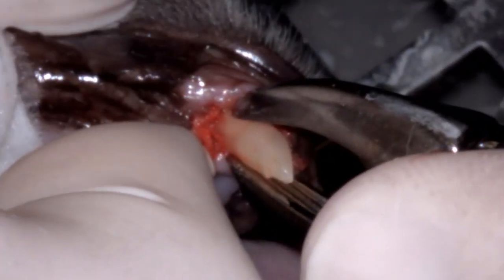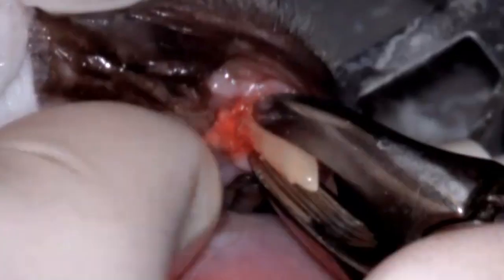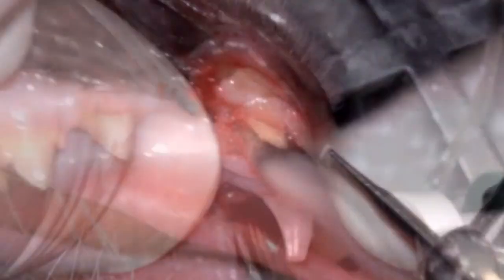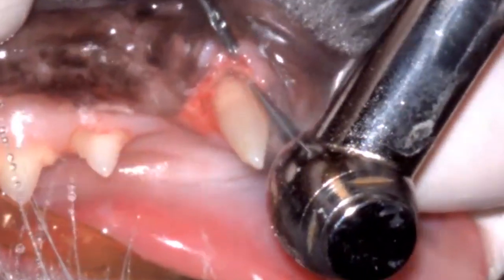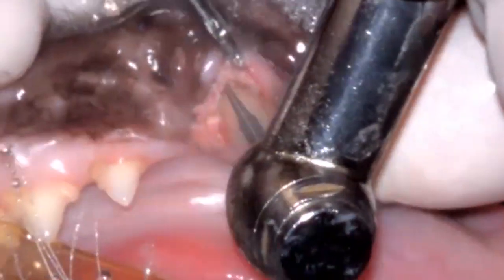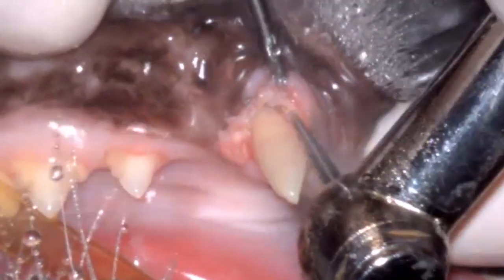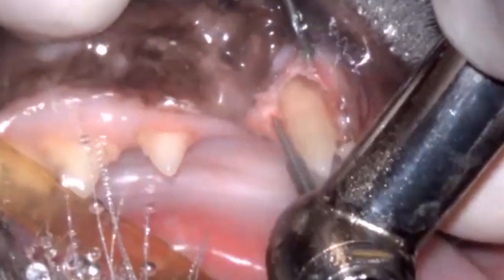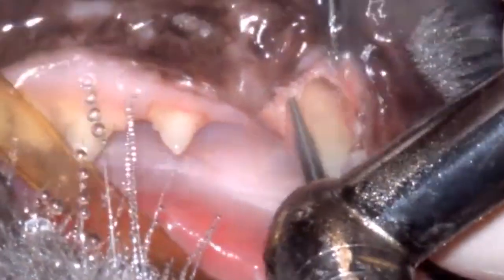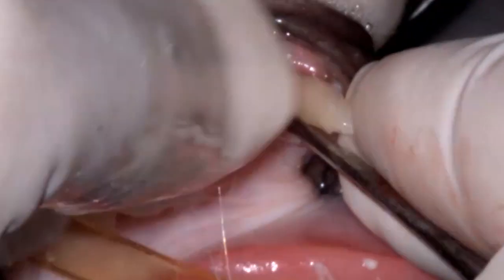At this point I felt I was getting some movement and thought I might apply a little rotational force to continue loosening the periodontal ligament. I applied my forceps but wasn't getting any movement, so back we go to the number 1 half-round carbide burr — removing a little more bone and creating a deeper moat around the tooth. I'm trying not to remove the labial plate but rather surgically breaking down the attachment between root and bone, decreasing the surface area holding the tooth in place. Then back to elevating, continuing to work away.